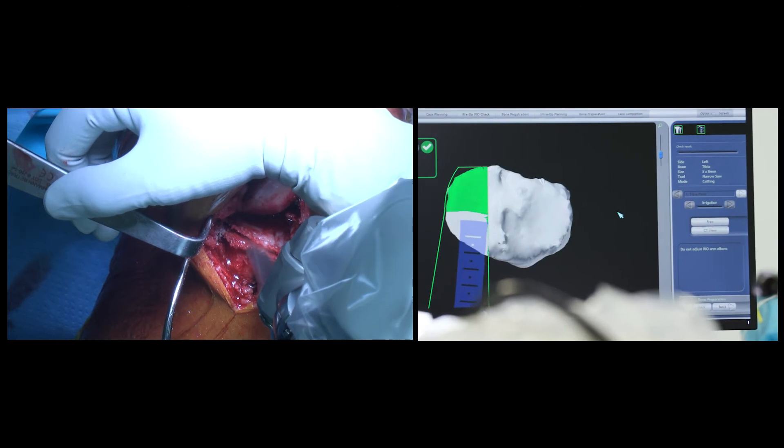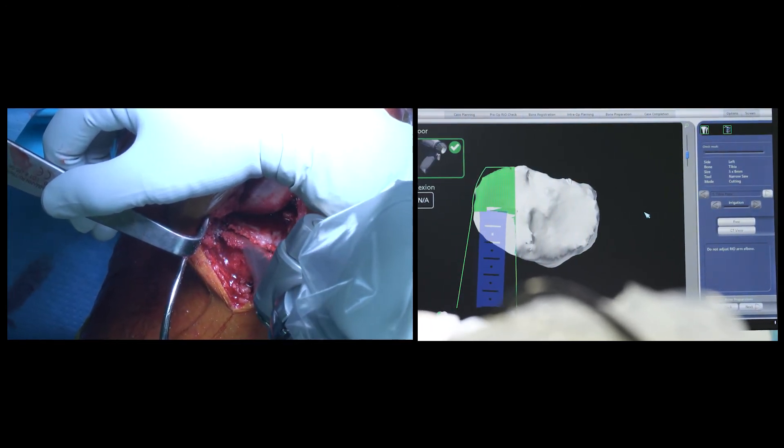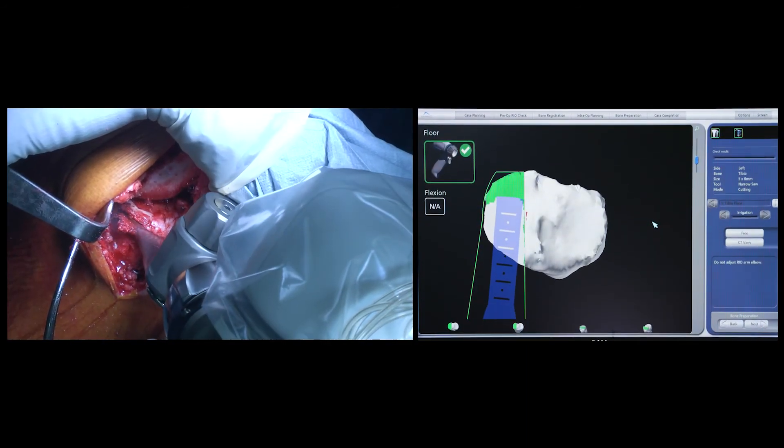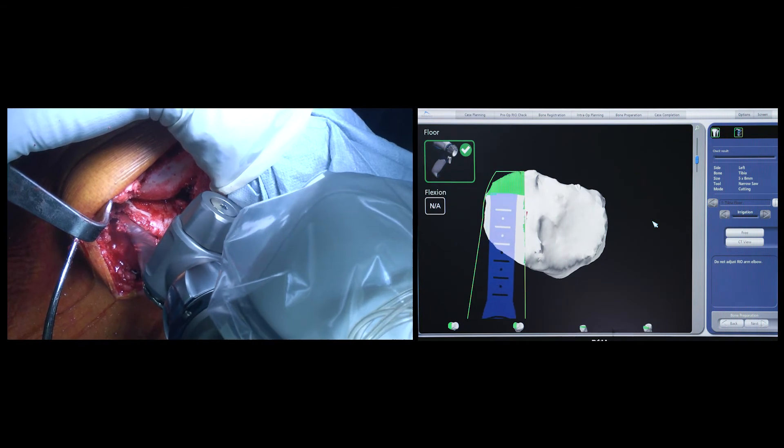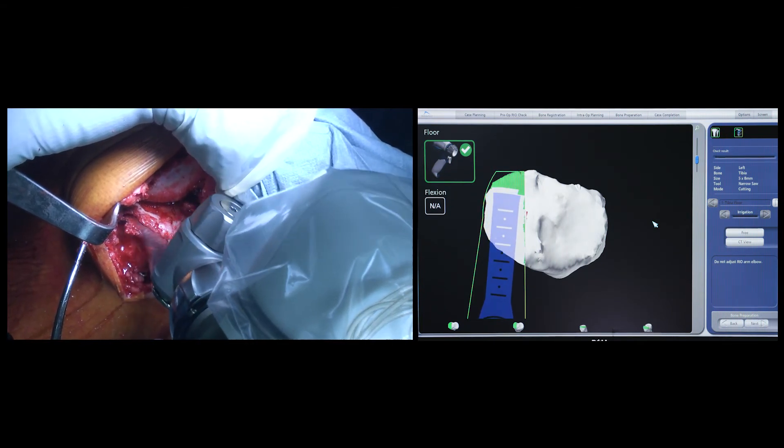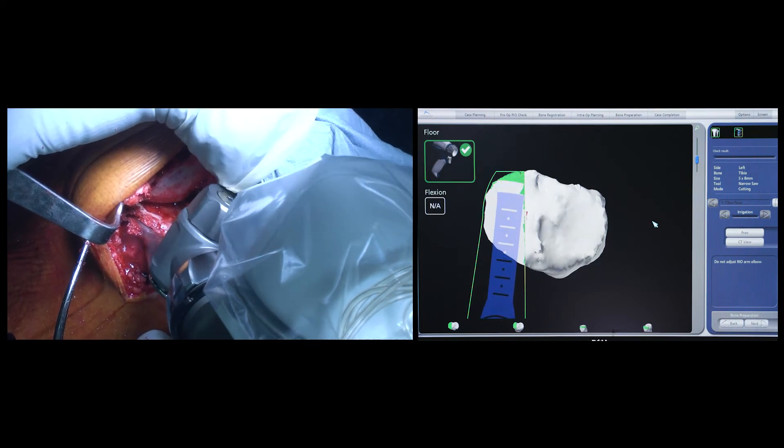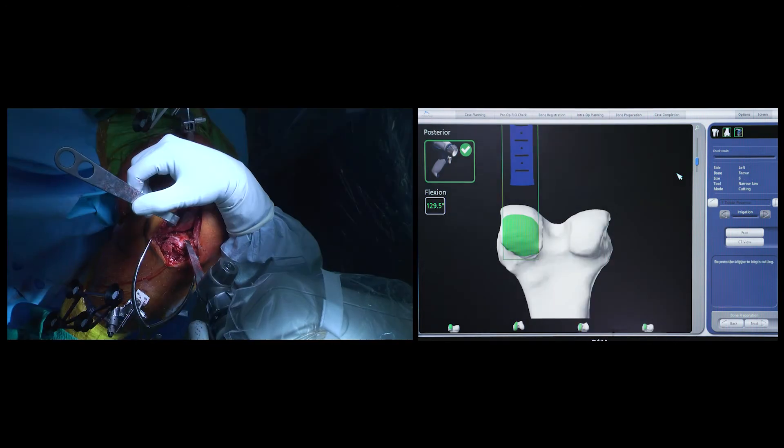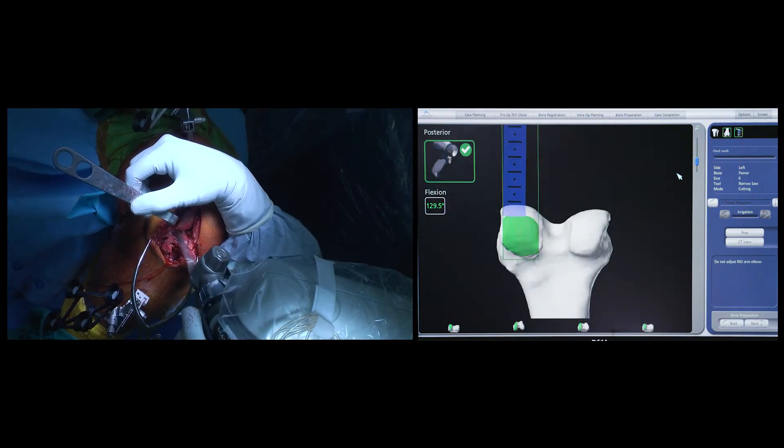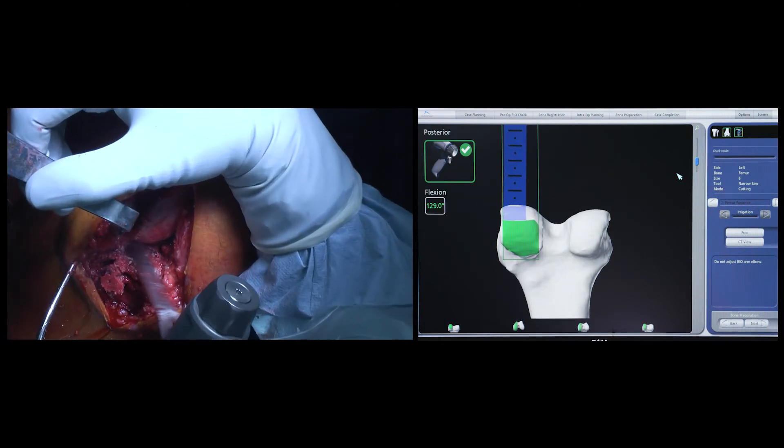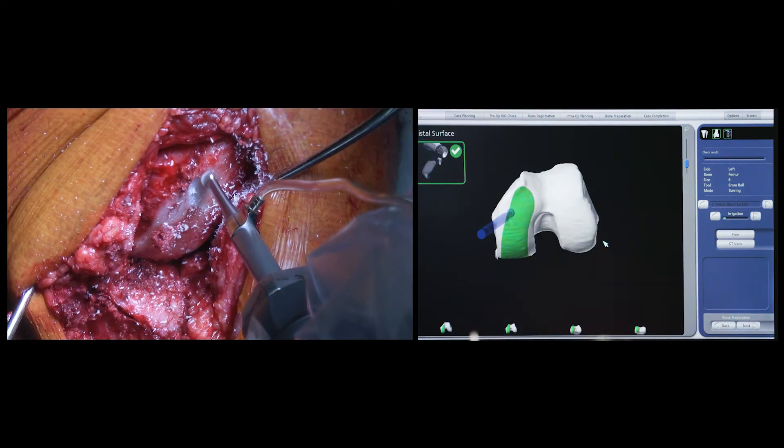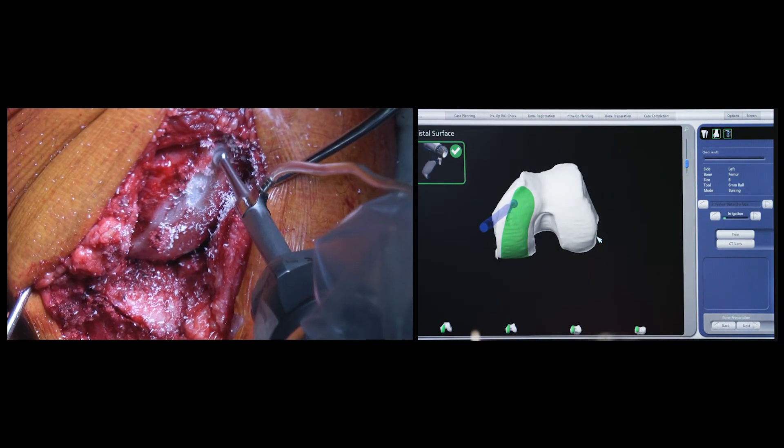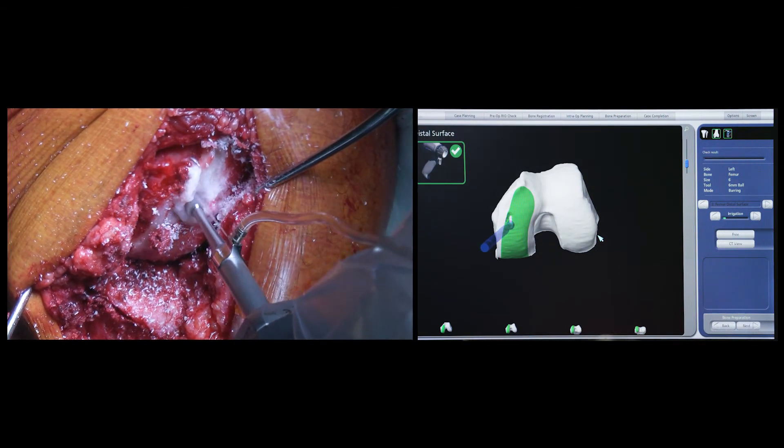As you can see from the screen on the right-hand side, there's a green boundary or corridor that is set very closely around the bone that is designated to be cut, and this means that if I try to push the saw outside of that boundary, the saw will immediately stop working, preventing me from inadvertently damaging some important soft tissue structures such as the medial collateral ligament or the posterior cruciate ligament. This is a very important in-built safety mechanism that allows us to safely perform this operation through a very small, minimally invasive approach.